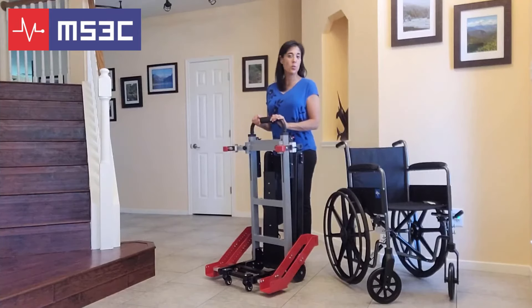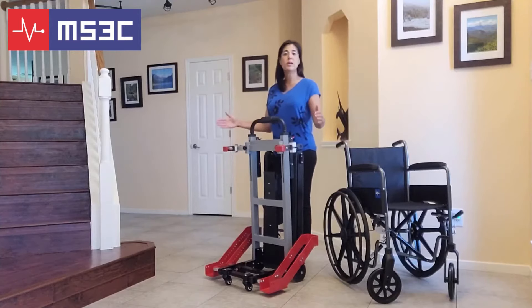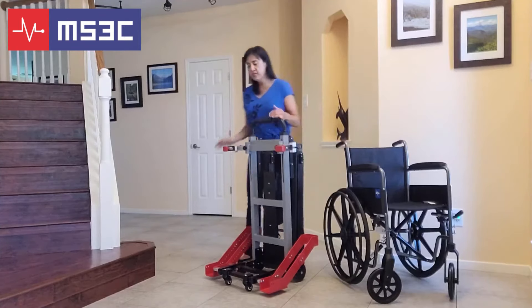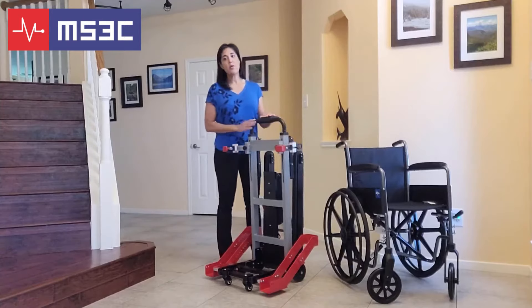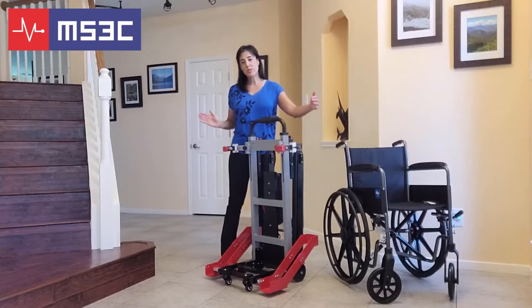The next part of this video is going to walk you through the steps in adjusting your trolley for your specific wheelchair. The first thing you're going to need to do is adjust the red wheel supports to the correct width of your wheelchair. These supports are adjustable, going from a minimum of 18 to 22 inches at the smallest, up to 22 to 29 inches at the widest.